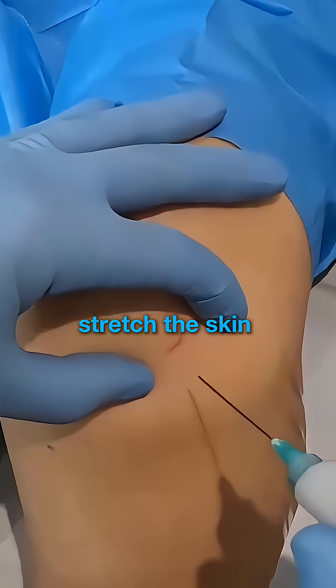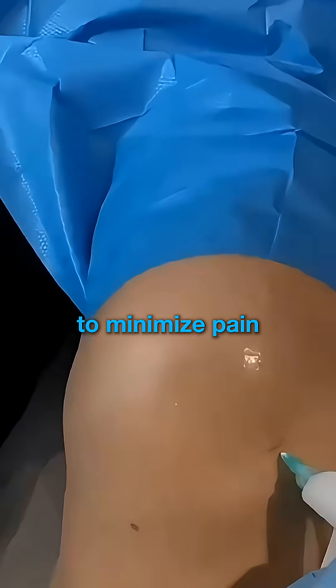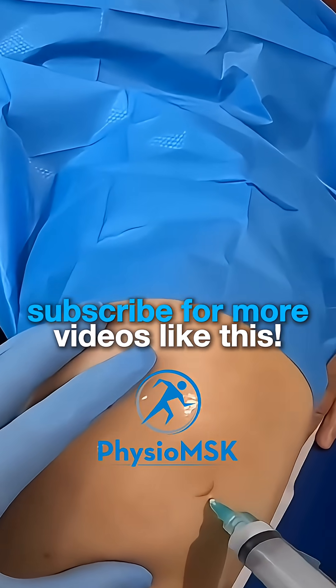Now, sterilise the area, stretch the skin with your free hand, and then introduce the needle decisively in order to minimise pain. The needle should be directed medially towards the centre of the knee joint. Perform a safety aspiration, and then deliver the injection as a bolus.